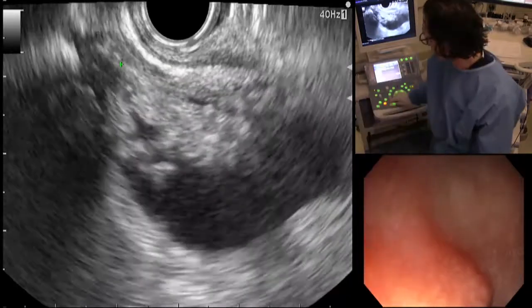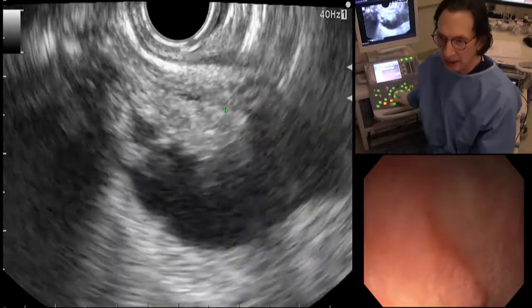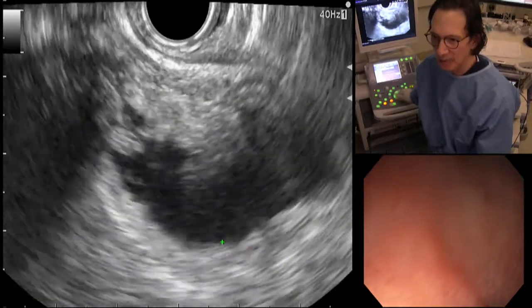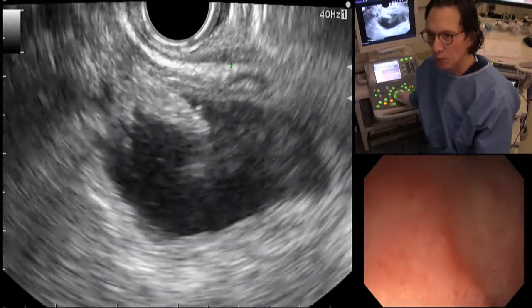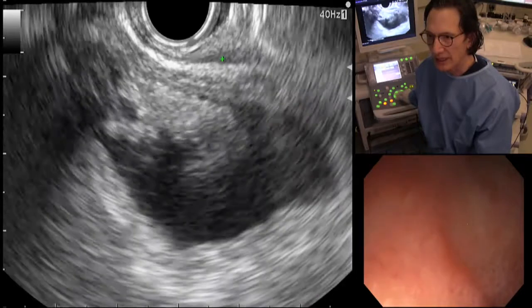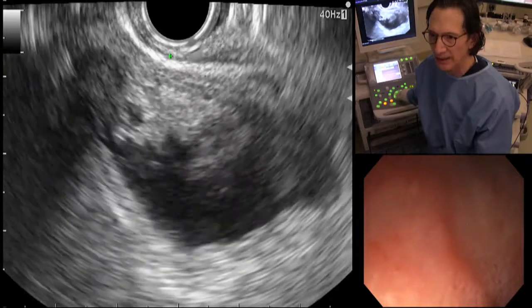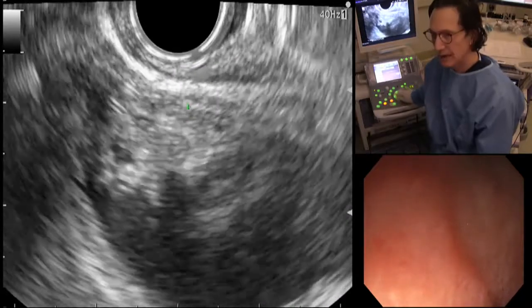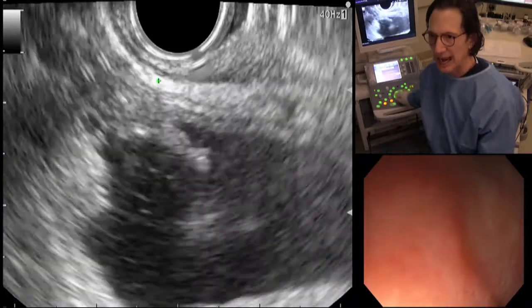And as we look at this, we're also evaluating, first determining what's gallbladder, is it the gallbladder, confirming that it's all the features that we would expect of the gallbladder. But also we want to know what is the relationship of the structure to the duodenal wall. So we see the gallbladder wall here. We see the muscularis propria of the duodenal wall here. We see there is an echogenic layer between this layer here and this layer here. Muscularis propria, duodenal wall. I'll mag it in a little bit more for you. So once again, muscularis propria, duodenal wall, gallbladder wall, slightly thickened, echogenic layer in between.